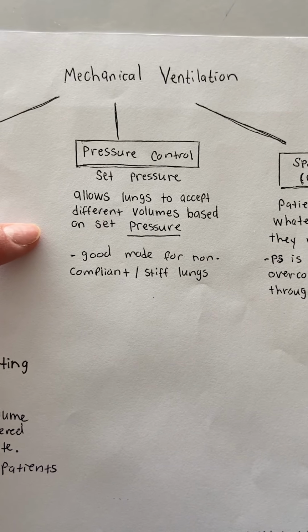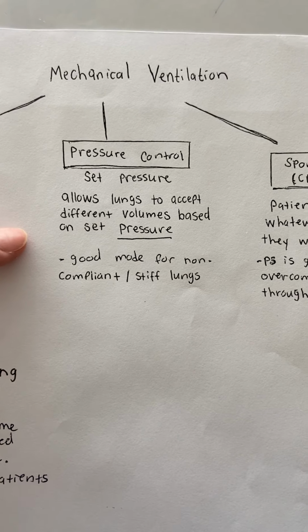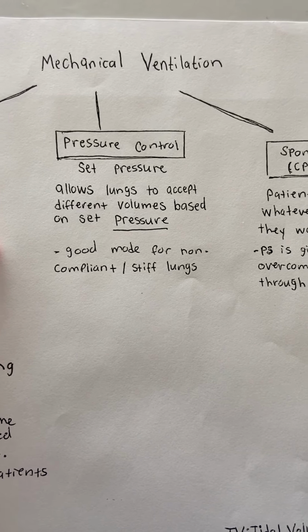If you ever see this, just grab your RT and ask them to kind of fill you in a little more. They're really great resources. And again, we don't see this a lot. So I'm gonna lean more heavily on volume control, but that's really what pressure control is, just setting a set pressure instead of a set tidal volume.